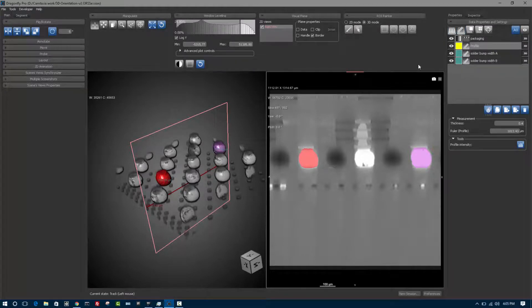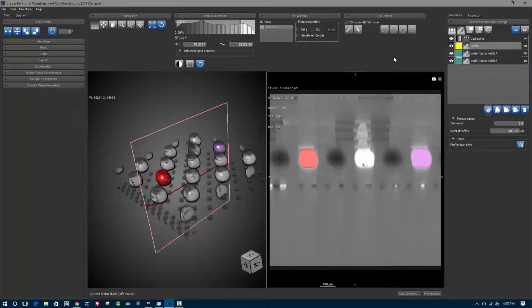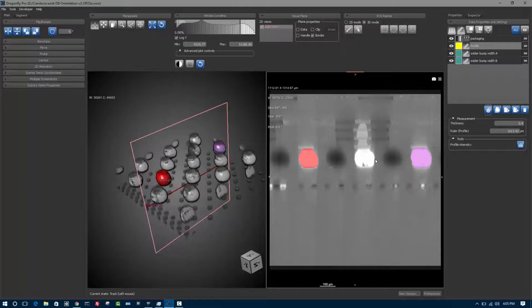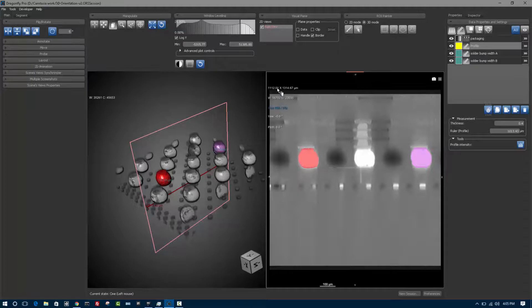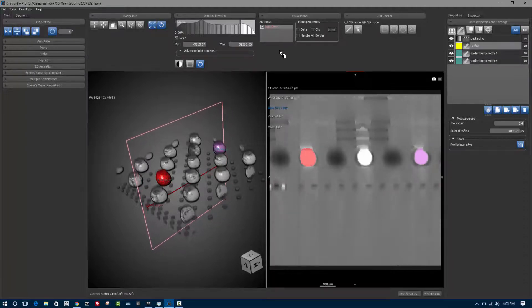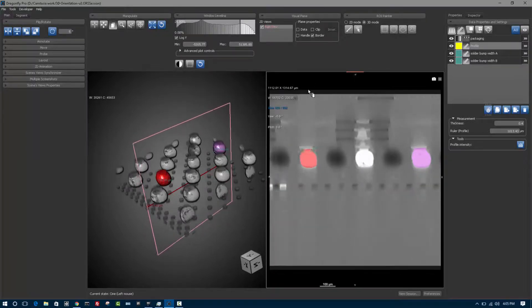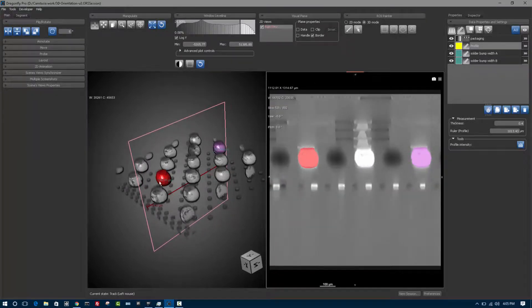The software is highly interactive and a lot of the elements play together. For example, I have a visual plane showing right now so you can see where this particular planar view exists in the 3D view. It's interactive. For example, when I change the slice number, you can see how it changes over here on the left view.